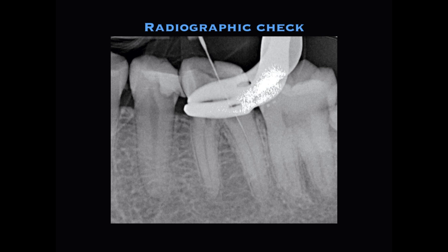I also tried to search for the buccal canals — the mesiobuccal canals — but I couldn't find them. In this x-ray there's something very important: my burr angulation is not correct. I've been tilting the burr and removing more dentin towards the perforation side. If I had not stopped at this point and taken this x-ray, I would have gone further and probably perforated, causing an iatrogenic error.